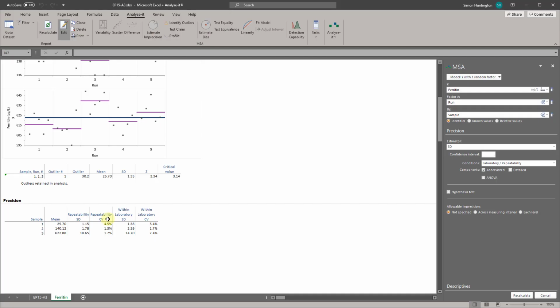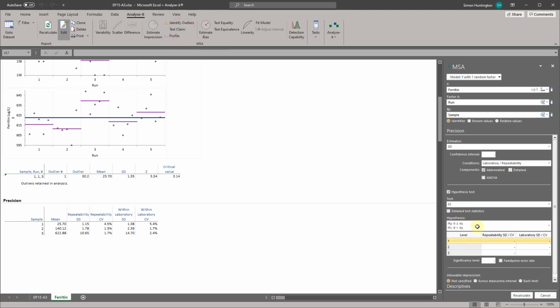To test the precision against the manufacturer's performance claim, in the Analyse-it ribbon tab, in the Precision group, click Test Claim. Now, in the Hypothesis grid, type the performance claims as an absolute value or as a relative value. For example, type 5 for an SD of 5 mg per litre or type 5% for a CV of 5%. In the Significance Level edit box, type 5% and then select the Family-Wise Error Rate checkbox.